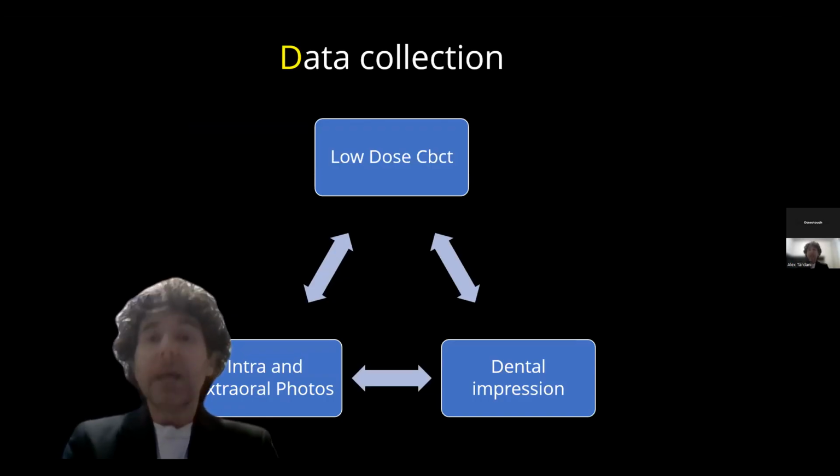impression, a wide one. And I'll tell you right now, even in this digital era, I am still a fan of a conventional impression, because the details captured with a conventional impression, even a simple alginate, are still superior to what we can obtain from a digital scan.